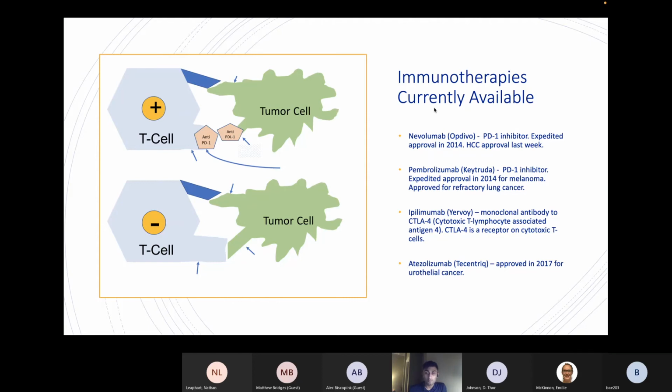And often, because lung cancer is the primary place where this is super useful, you're either ablating a lesion in the lung, or you're ablating a bone lesion, or you're ablating the adrenal gland. Those are kind of the most normal places, perihepatic lymph nodes, which is sometimes a little bit sphincter tone inducing. But those are the kinds of areas that you're ablating, and you can really do good things for these patients, even though you think, oh, it's a local treatment for a person who has widely metastatic disease. But in the age of all of these immunotherapies, this becomes increasingly important.